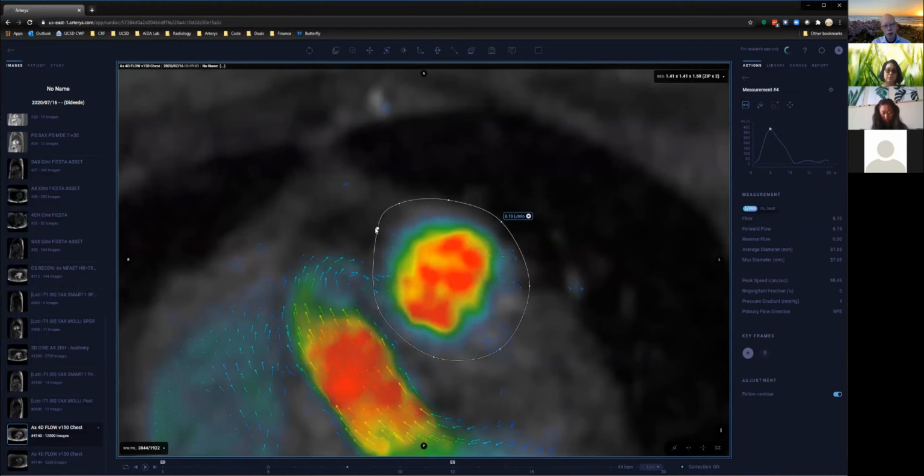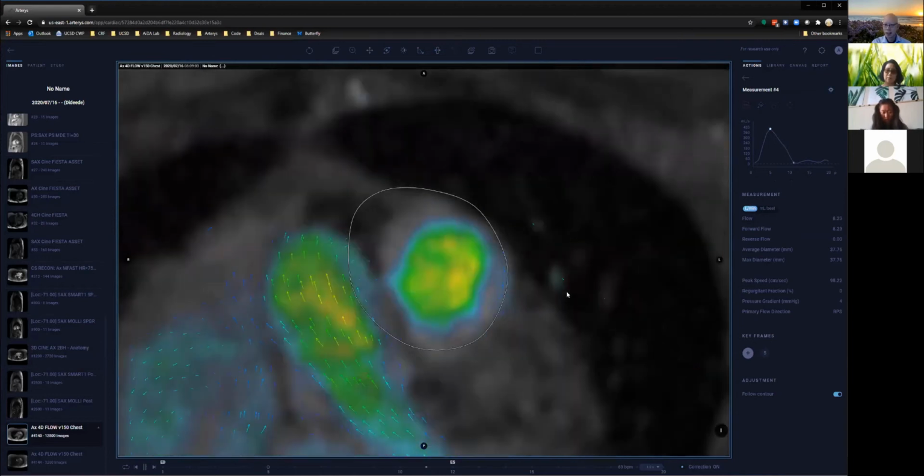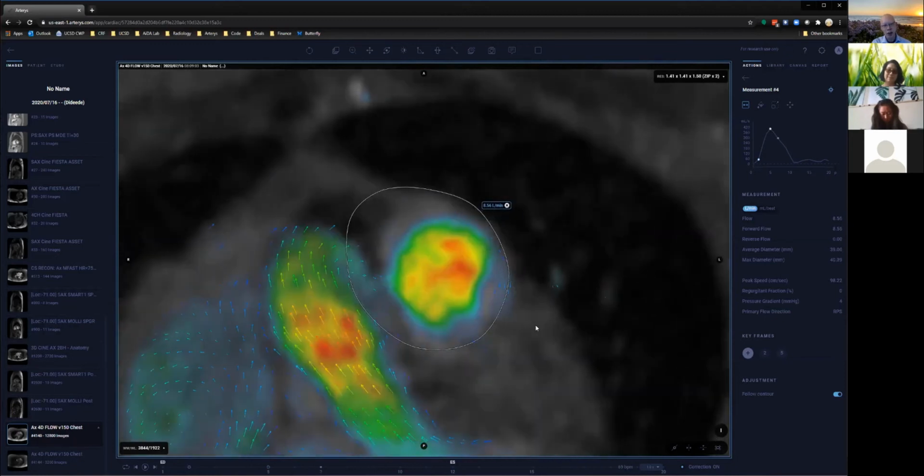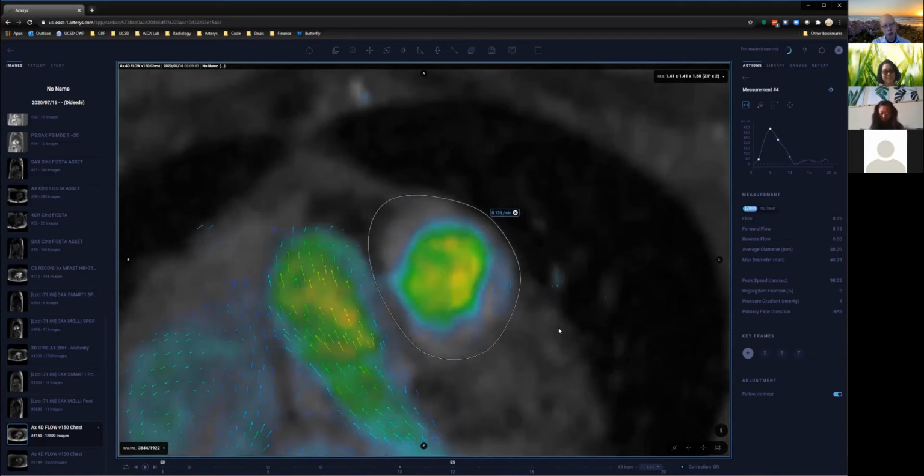When's the last time you went to the scanner, Misha, for a congenital heart case? For congenital, I cannot remember. Probably when I was a resident. Probably when you were a resident, I know. Which wasn't super long ago, but at least a couple of years. Yeah, and I can't remember the last time I did too, but I cheat because I sometimes connect to the scanner remotely. But not to plan any specific planes anymore, like I would have in the past.